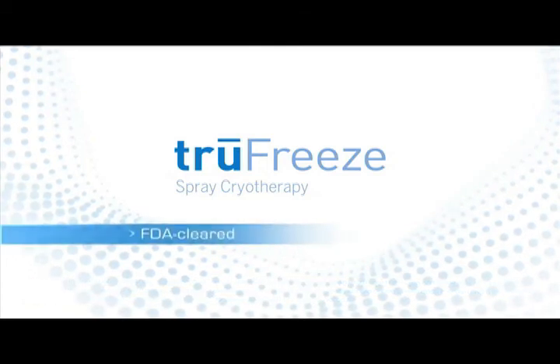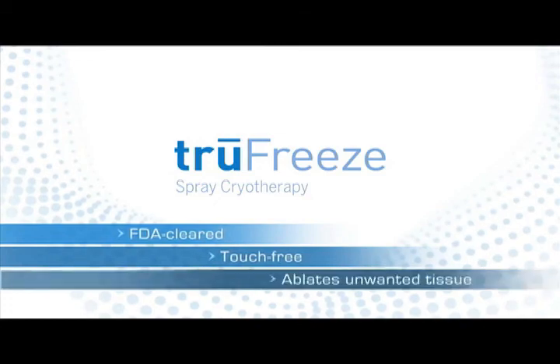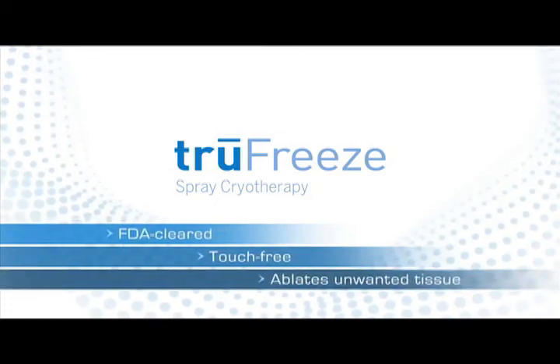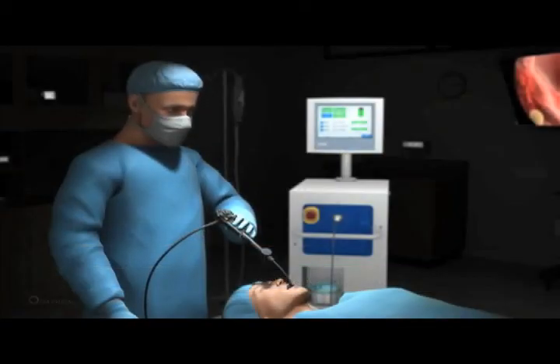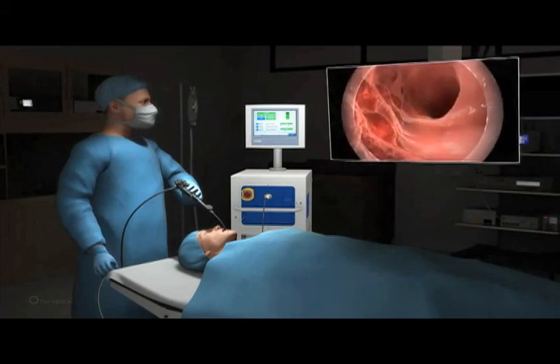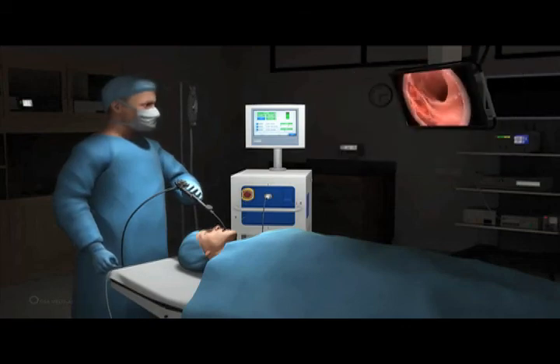The truFreeze system is an FDA-cleared, touch-free device that ablates unwanted or obstructive tissue using spray cryotherapy. Spray cryotherapy is delivered under physician control and performed with direct visualization. In the first step of the procedure, the physician visually determines the target ablation area using a standard scope.